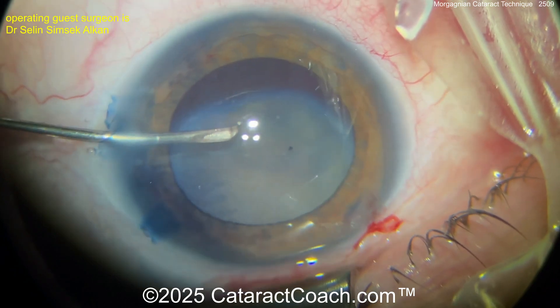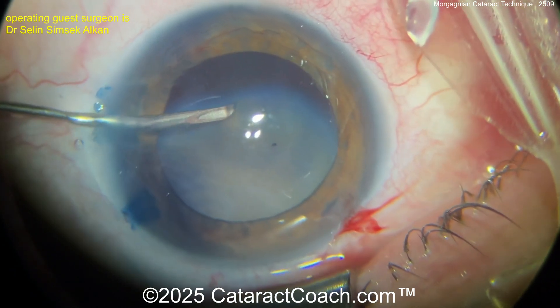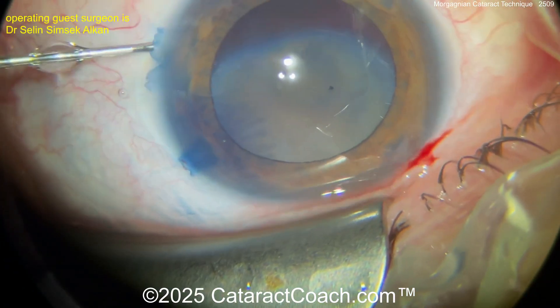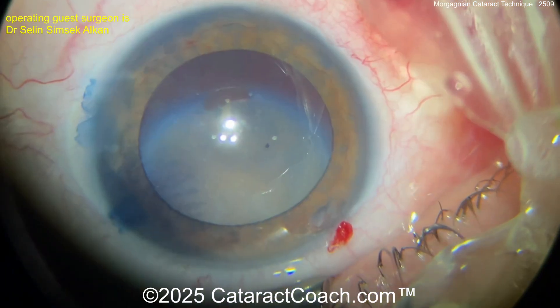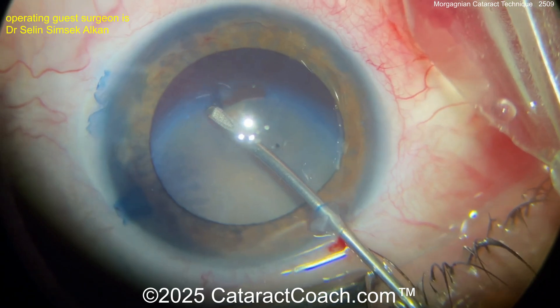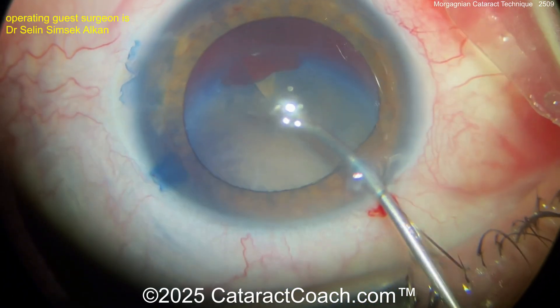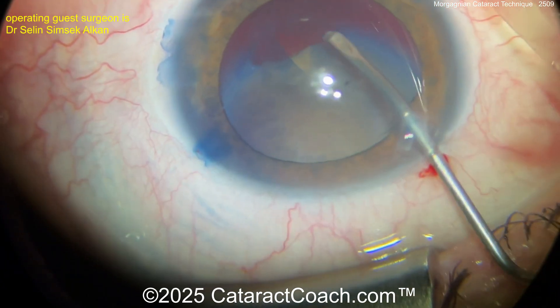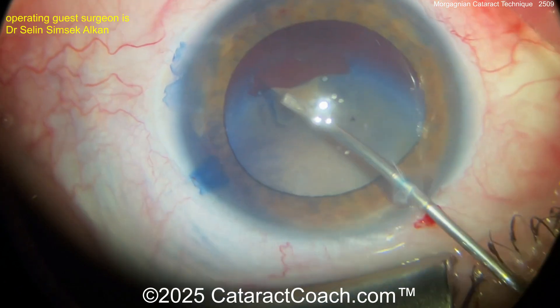What I like to do is inject some viscoelastic in the anterior chamber, but also a little bit of viscoelastic in the capsular bag. Why? We've got to replace some of the volume that's been lost. That liquefied lens material that you aspirate out is gone, and you'll have a much easier time getting the rhexis done if you replace some of that volume.